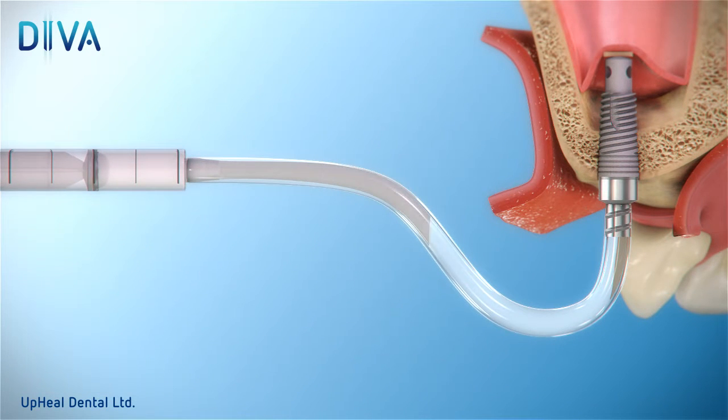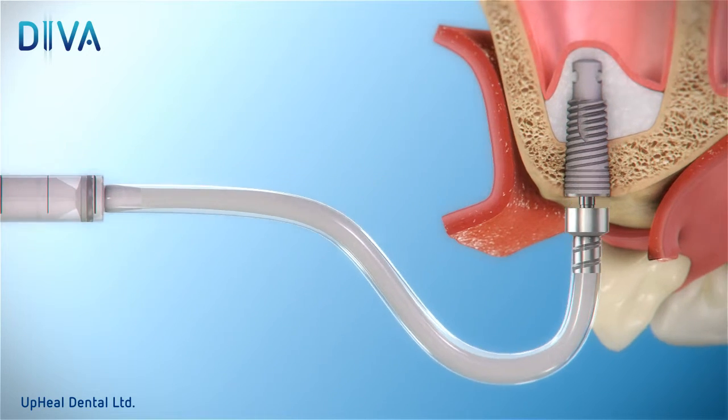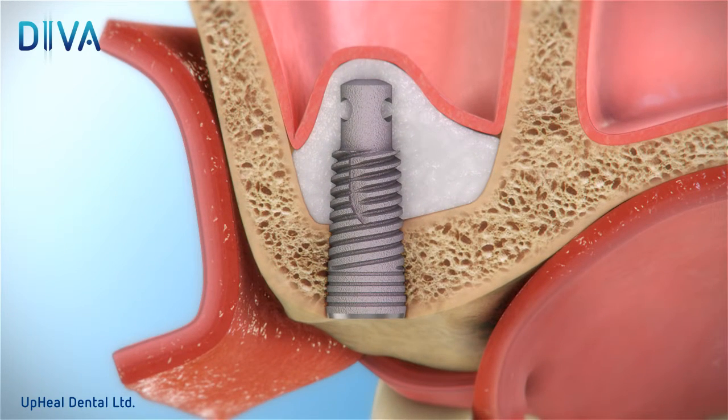Next, use the bone syringe to inject bone substitute through the connector. Detach the connector and screw in the second valve screw included in the device kit to achieve absolute sealing.